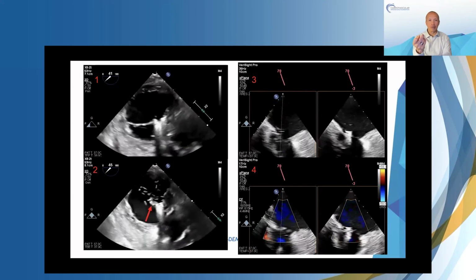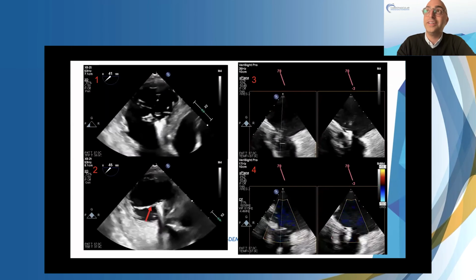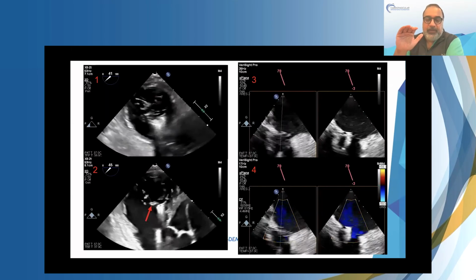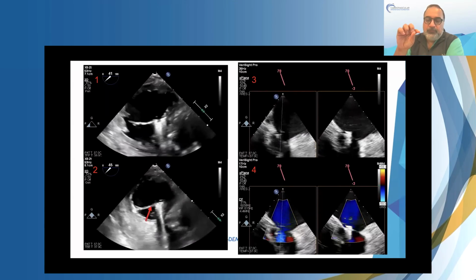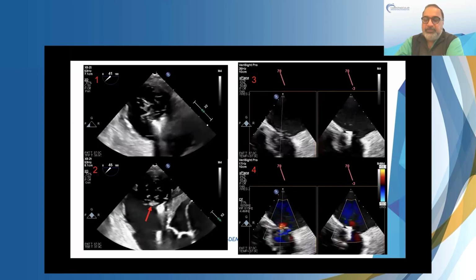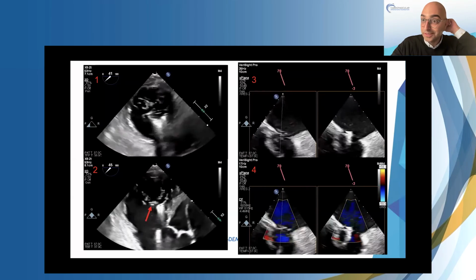Well, I'm just looking at this picture here. You've only gone 3, and it's completely different. Yeah, exactly. I totally agree with you. Right now it moves with a trackball, right, Edris and Nadira? Yes. One of the feedbacks that we've had for Philips is to try to put this on a dial, so you can easily go from -3 to -4 to -5, because with the trackball it can go from -3 to 10 in a quick second, and sometimes it's just a matter of 1 or 2 degrees to see something like that. I would recommend no coffee before a tilt elevation.